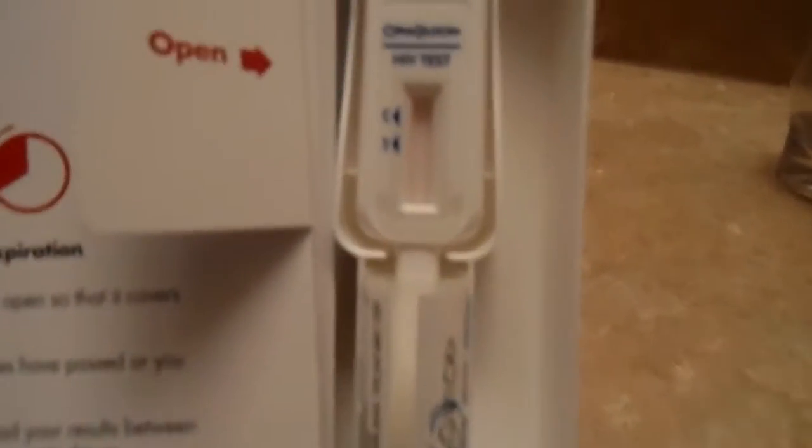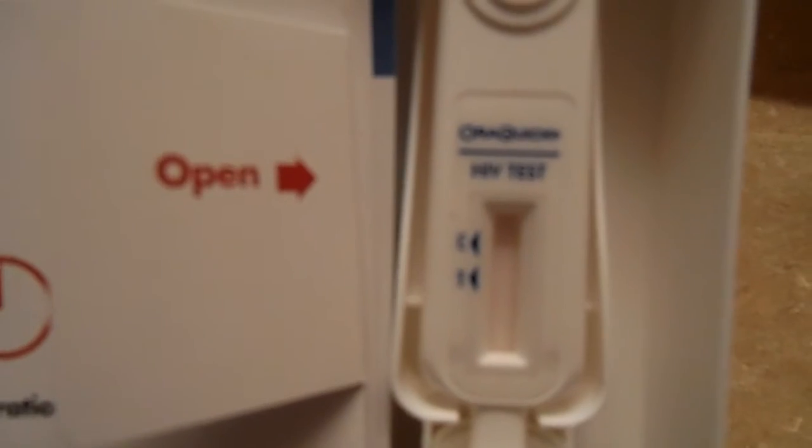It says one line is negative, two lines means go see your doctor. Let's look at the result. Okay, we can do this. As you can see — is it focused? I want y'all to see it. It says one line. Oh, thank you Lord Jesus! Oh girl, oh girl, okay!